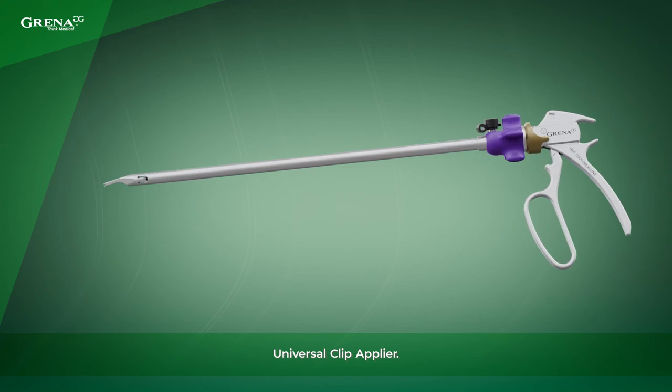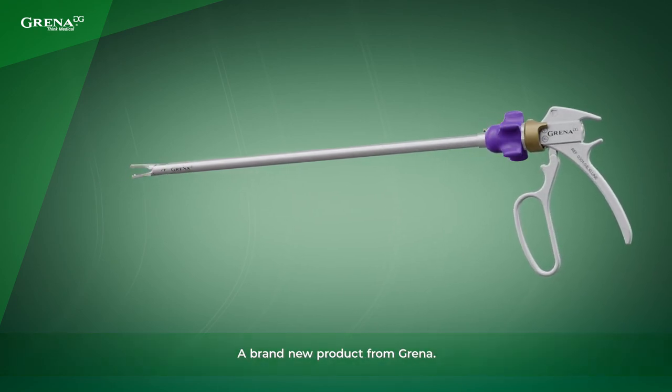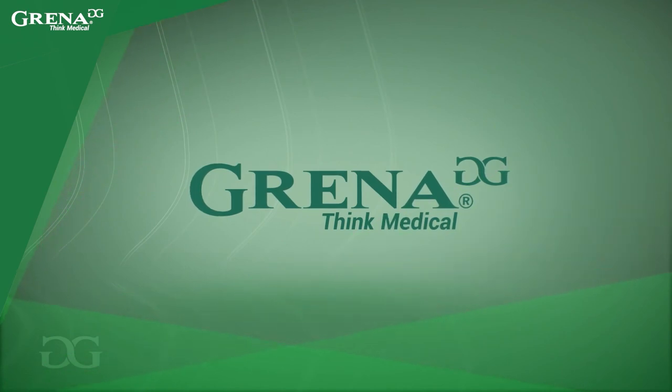Universal Clip Applier — a brand new product from Grena. Grena. Think Medical.